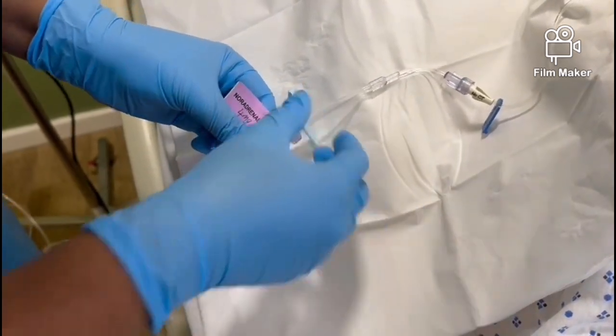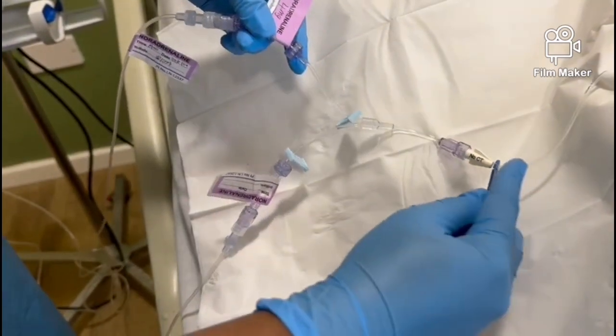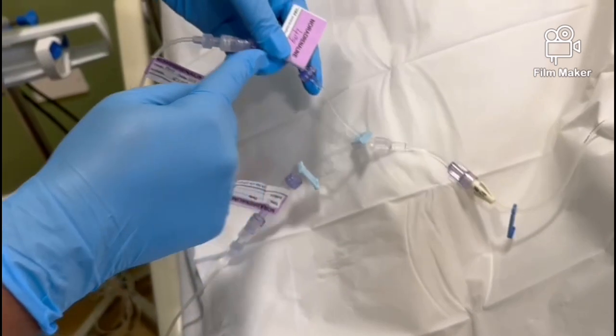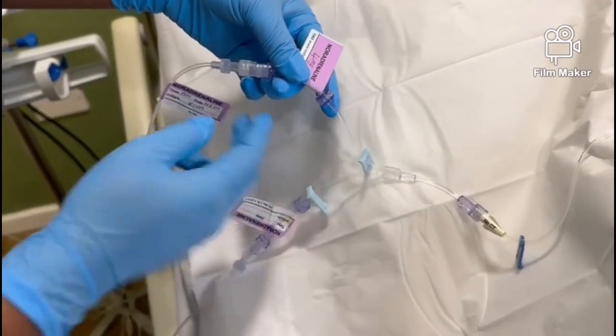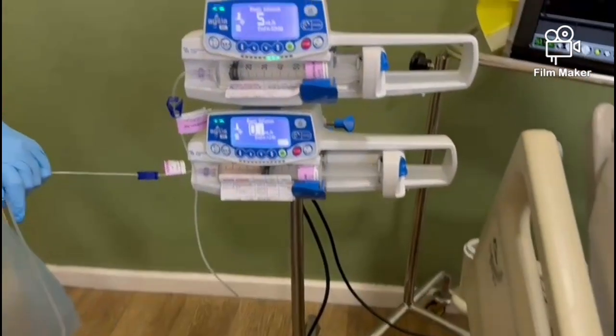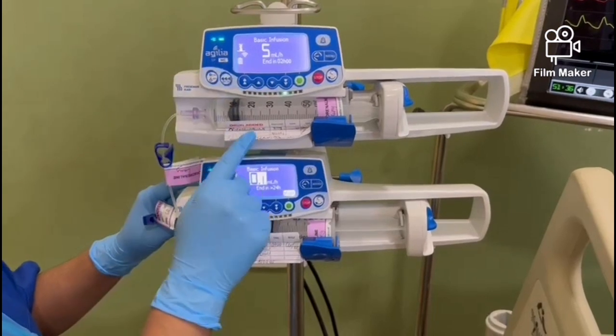Once connected, unclamp the line. Ensure all the other lines are unclamped and follow your line back. Ensure the clamp nearest the syringe is also unclamped before setting the rate.